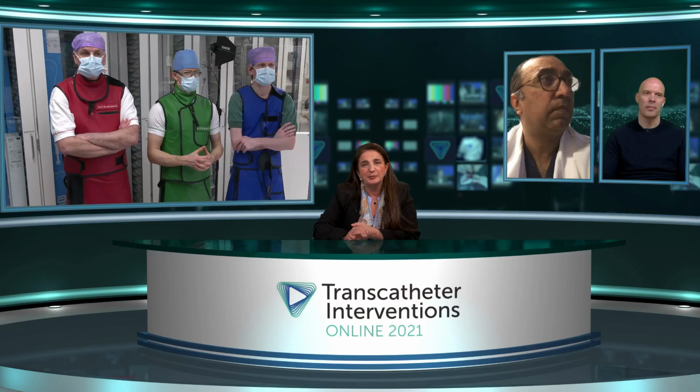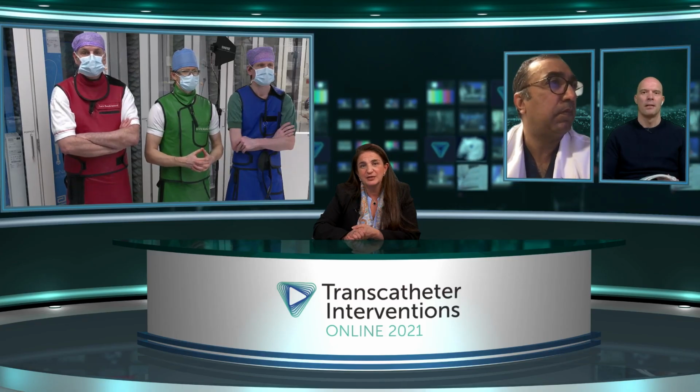So let's hear from our panelists. Nicholas, what are your thoughts about this before we go, just to wrap up with Lars and the team and why they chose that device over Watchman?